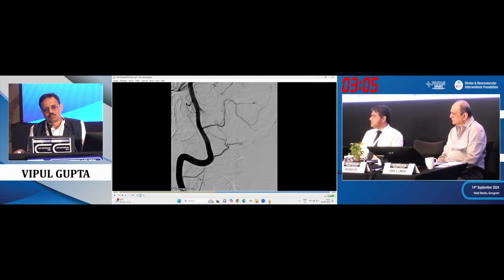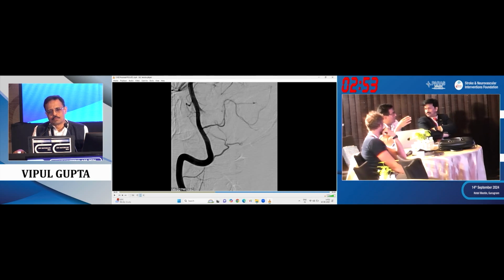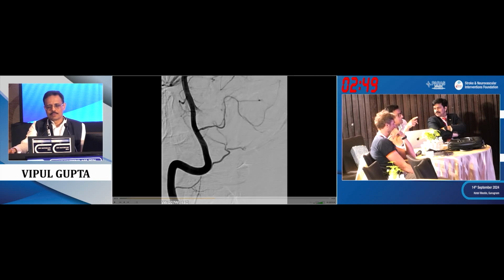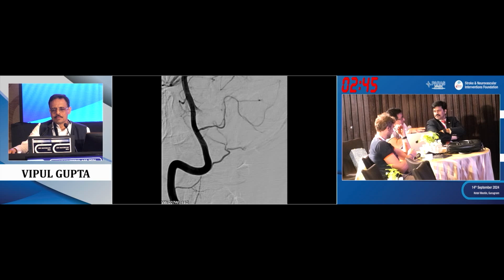Well, I know you always talk about being very conservative and safe, but I think in this case, all the manipulations were quite risky. Good in your hands. I probably would have tried the same maybe, but I think when it was going like that, you need to still consider parent vessel occlusion. It's probably the easiest and the safest technique. Just close that, and you're not doing any manipulation.